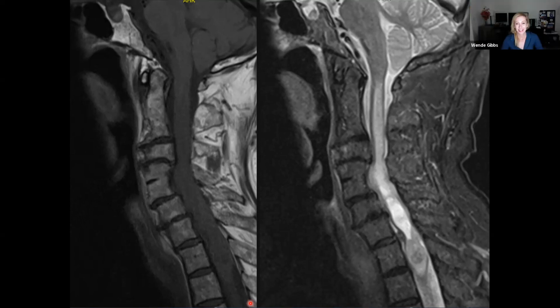For me again, this is not the result of trauma, like a dinged cord from that fall at that narrow level. This is way more extensive. You've got a well-established syrinx down below that level. So maybe, I don't know. The top looks a little hazy, like it could still be edema up near C1-2. But the bottom aspect of this, that's definitely been there a while.